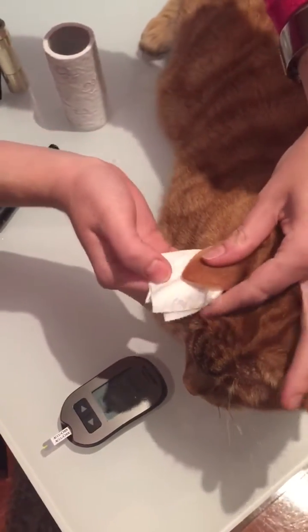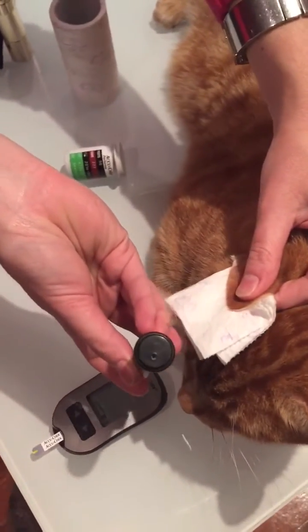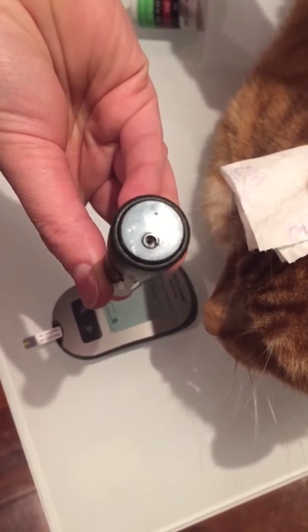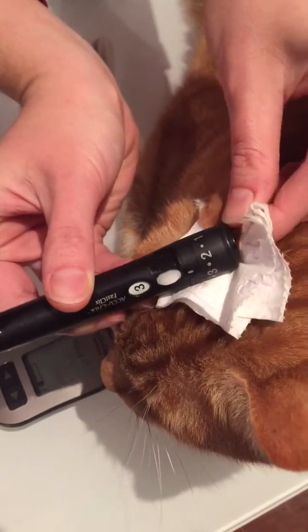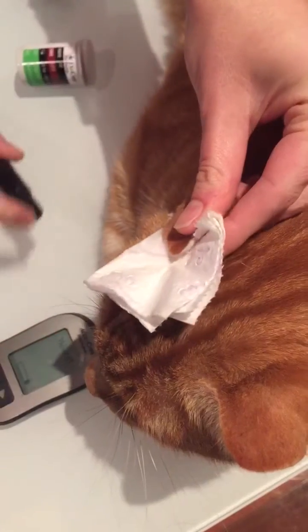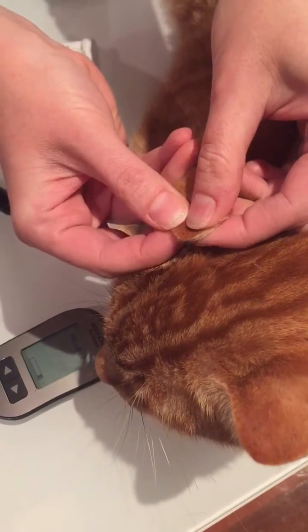So I'm just going to pop the tissue here, and with the lancet pen I'm going to need to aim it, because it's not actually quite centrally located where the little lancet pops out, so it can be a little bit tricky. I'm just going to depress it and hold it just for a couple of seconds, and then remove the tissue — and a tiny little droplet is forming.